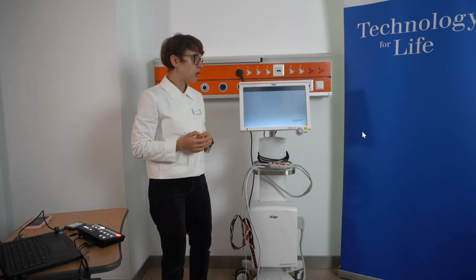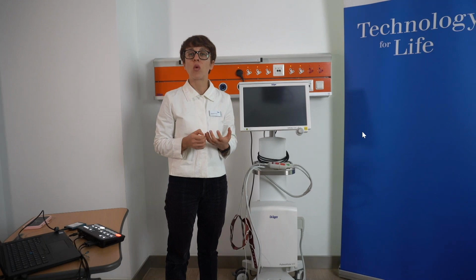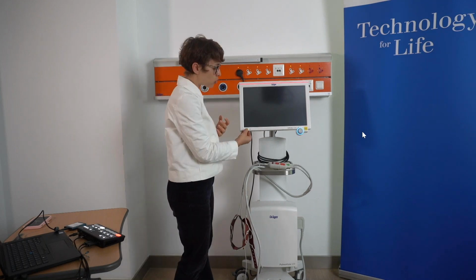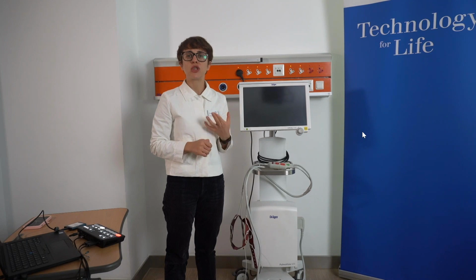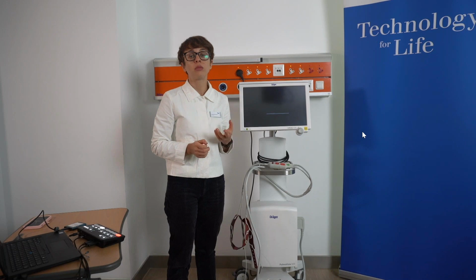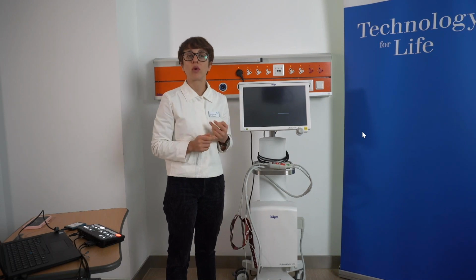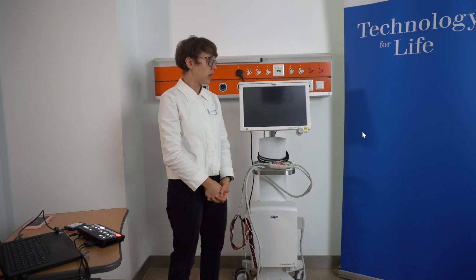In your clinical practice, you could also record every single measurement that you take with PulmoVista. Just as a reminder, whenever you start the PulmoVista measurement, press the record button, and then the recording will be available to you in the files.